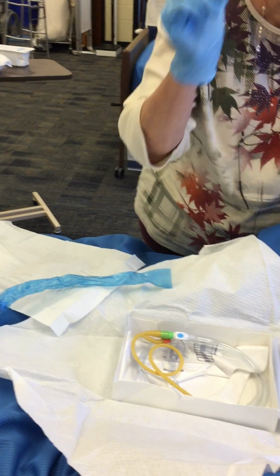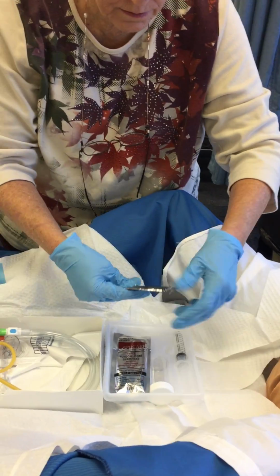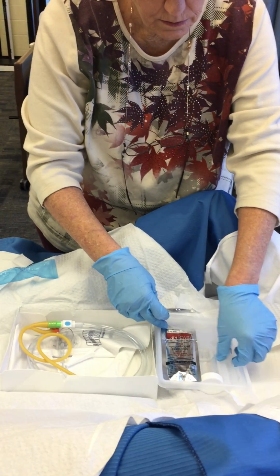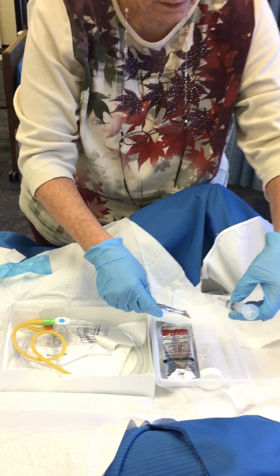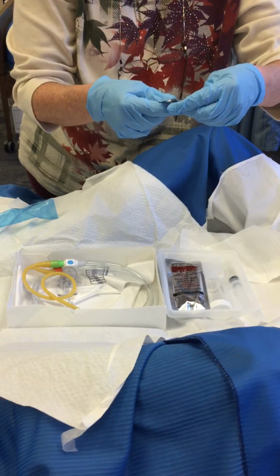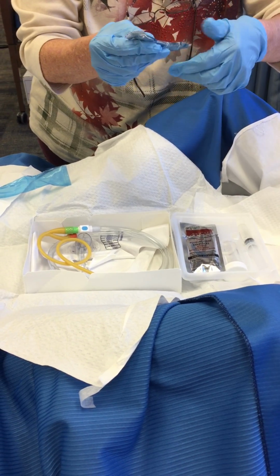It's better to miss your garbage bag than to mess around with it and get your hands dirty. This is your lubricant.